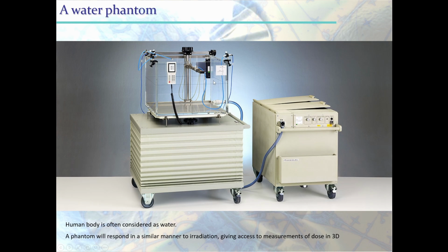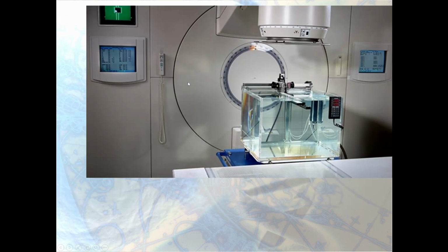You will also need to perform dosimetry in a water phantom. And why do we need that? Because the human body is often considered as water. Human body equals water. And this device will be very handy for studying the dose being deposited by a beam into what will be a human body, but is just water, much easier.